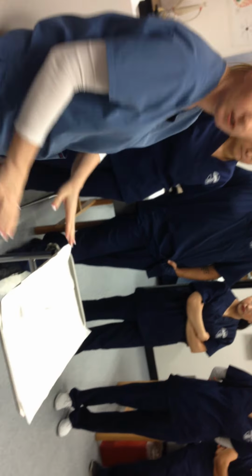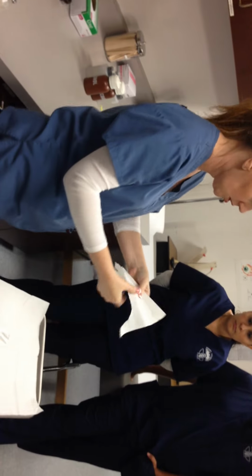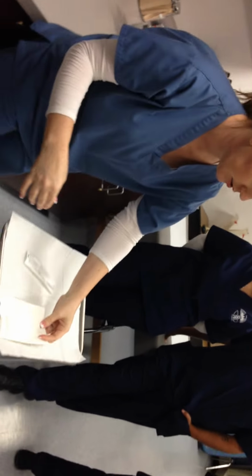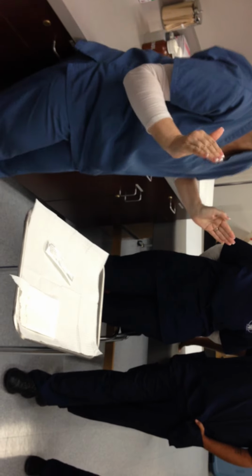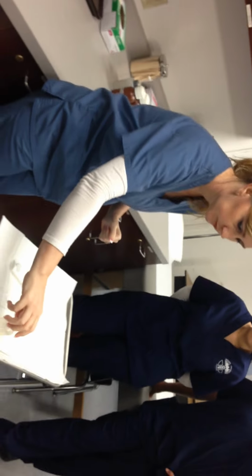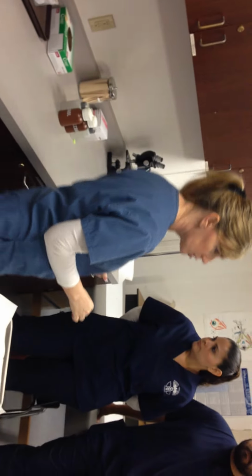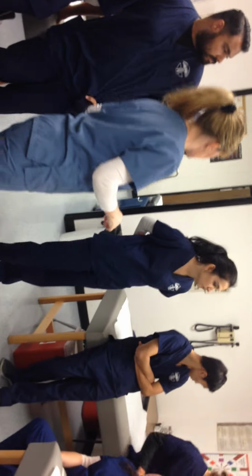So how do we make a dirty area? We come over here and we grab a little paper towel. Super fancy, right? And you're going to set this over here, and here's my dirty. It just keeps you organized. Does that make sense? Okay? So you're going to put this on here. And here's your syringe.